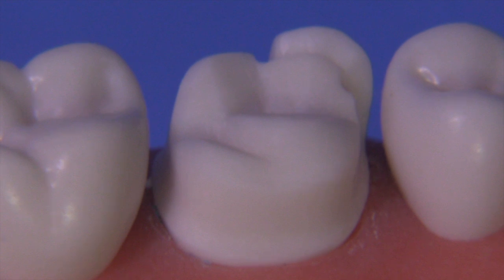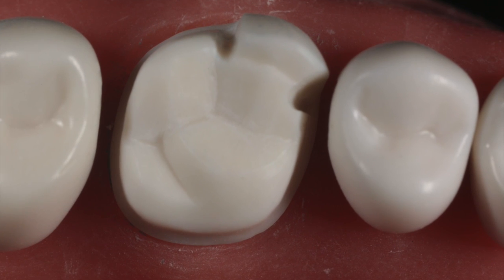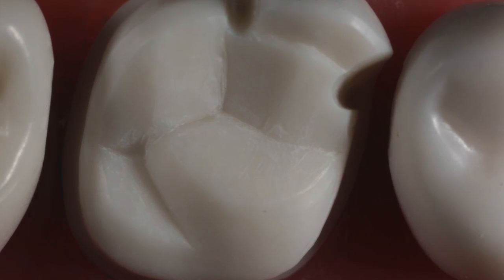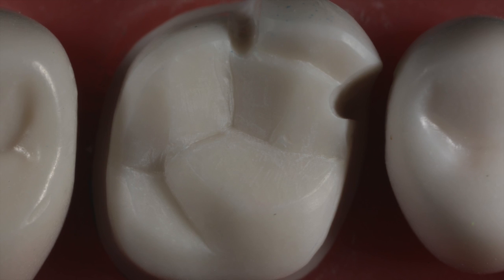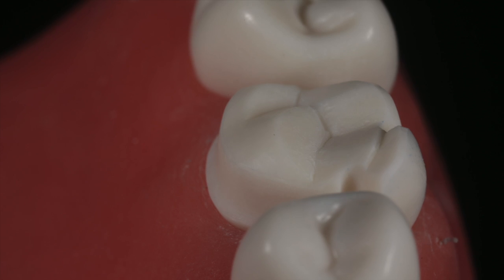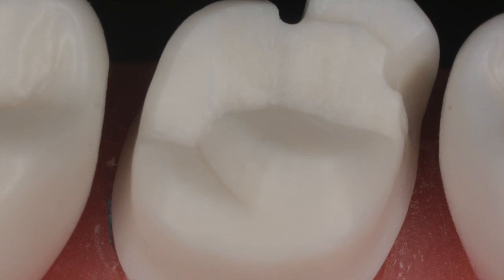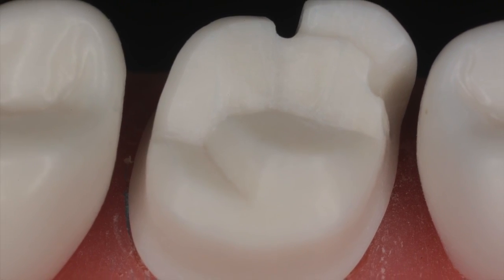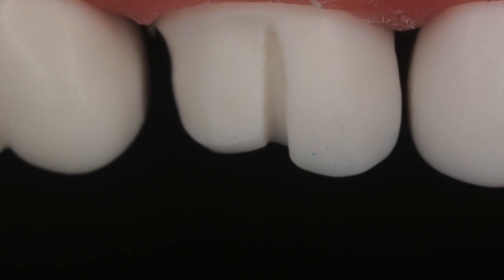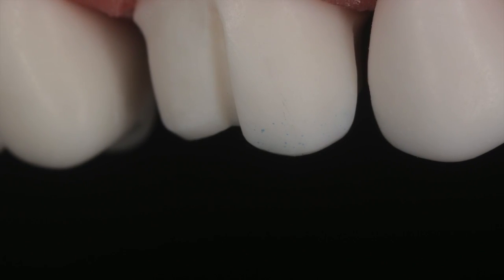If you happen to hit the adjacent teeth, just make sure you smooth them with a disc. That sometimes happens, but you'll get better at that by practicing. I really like this preparation and I try to do it as much as I can in patients who will allow me to use gold, particularly on second molars and sometimes first molars. We can even do it on lower teeth, but that's a completely different preparation — maybe I'll do that in the future. I hope everybody is safe during this pandemic. Let me know what you think of this video — take care.